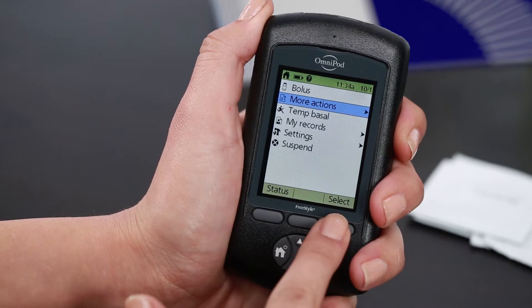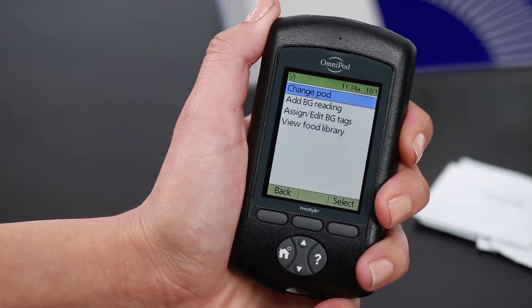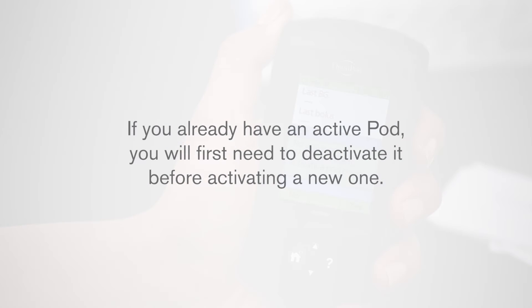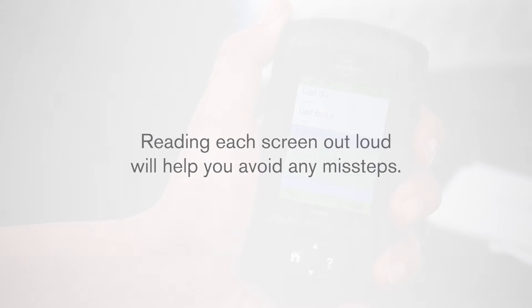When on the home screen, select more actions and then select change pod. Your PDM will now take you step by step on how to fill and activate a new pod.